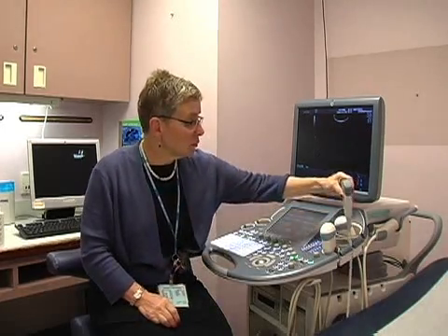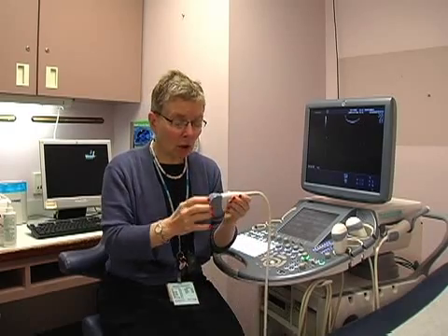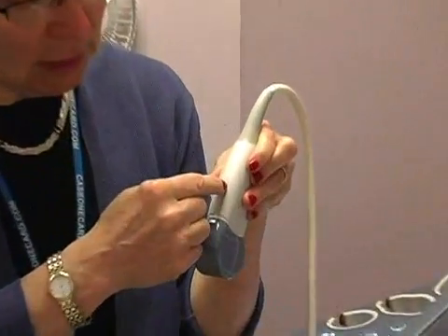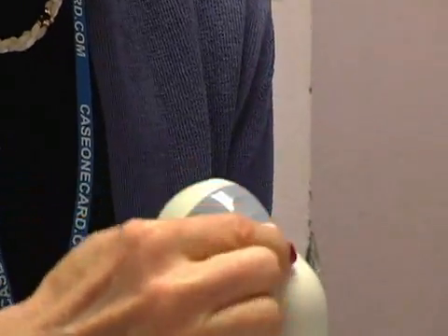I'm going to orient you to the probe. This is one of the ultrasound probes that we have, and you'll notice on the side of all ultrasound probes there's going to be a notch. In this case you can see it runs here with another notch, and this probe as well is going to have a notch that you're going to see on the lateral side of the probe.